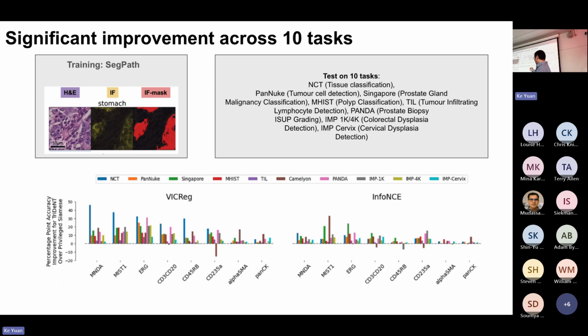One is VICReg, in terms of aligning. This is really a method that we like a lot. The reason we like it is that it has a very nice variance stabilization property. The other is the traditional canonical contrastive learning case.